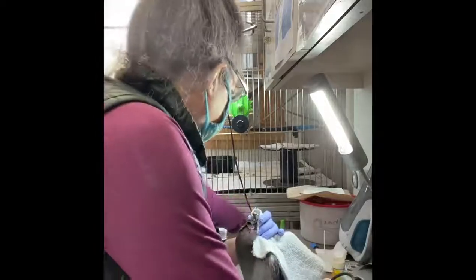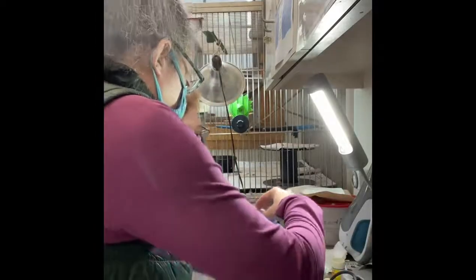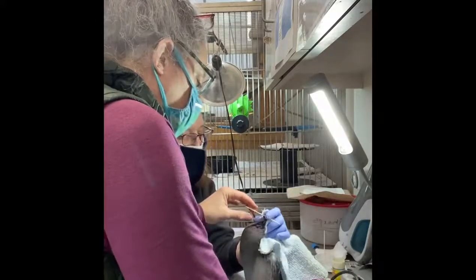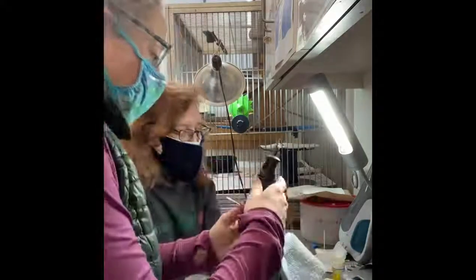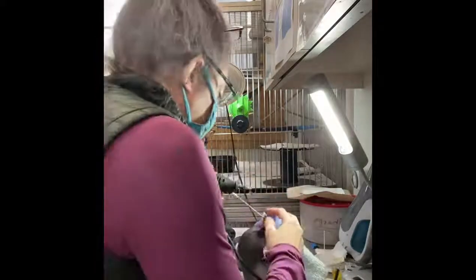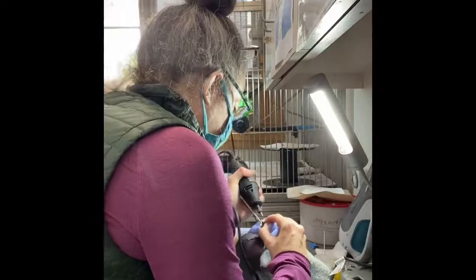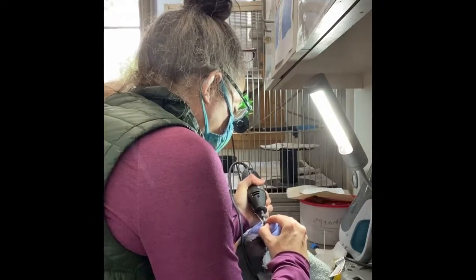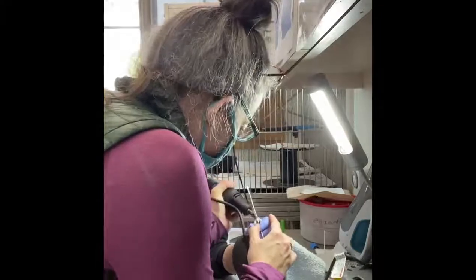I think I'm just going to try trimming now. I think the tip is going to be a little too wide — that's just the way the shaft is. So I'm going to trim it in here. It's a glamorous slice of animal care.